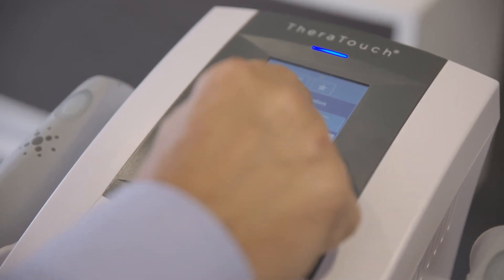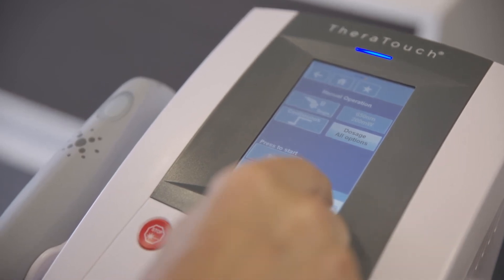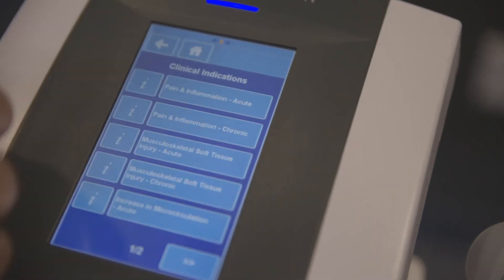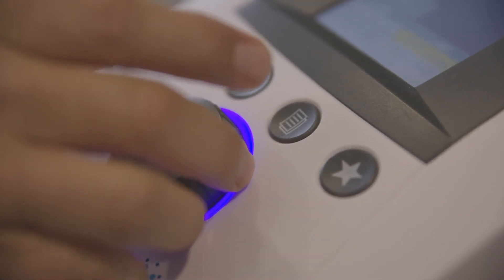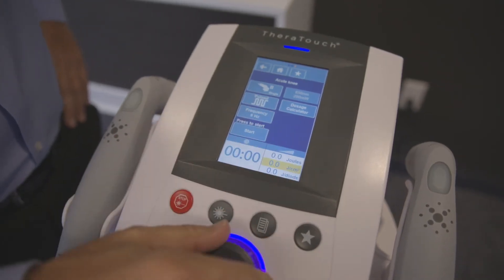When setting up treatments manually, you can quickly set the output according to the prescribed joules, joules per centimeter squared, or joules per diode. The LX2's built-in dosage calculator displays each of these common dosage measurements so you can quickly discern the desired energy dosage for your patient.